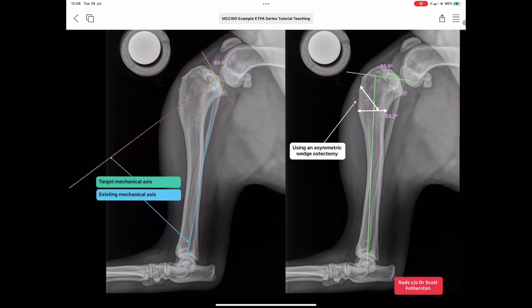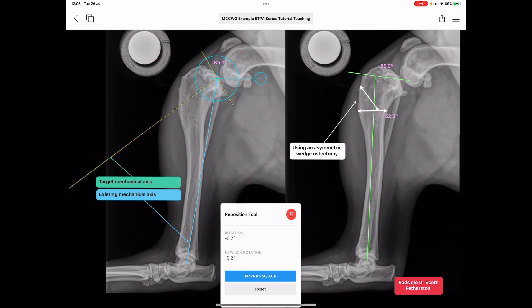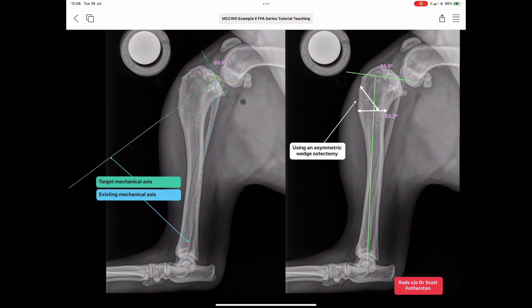In these duplicated images on the left, we have a proximal target mechanical axis based on the target post-op TPA of five degrees, and we're looking to align it with the blue existing mechanical axis. The existing mechanical axis is defined via our known landmarks: proximally at the intercondylar eminences, distally through the center of the talus.